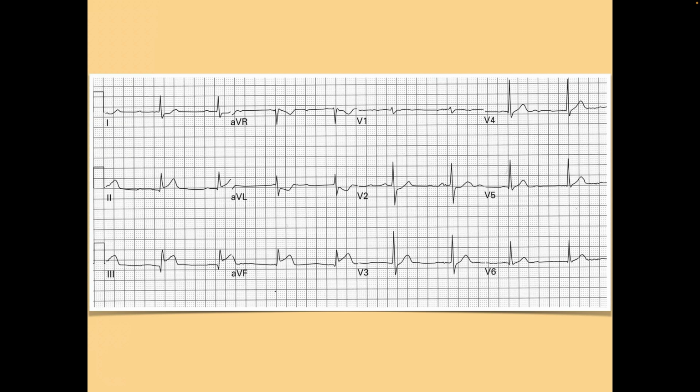Kyle, can you point at the J point in 3? Good question. Yes, that's correct. Since that's so elevated, if you think that's so elevated, just wait.